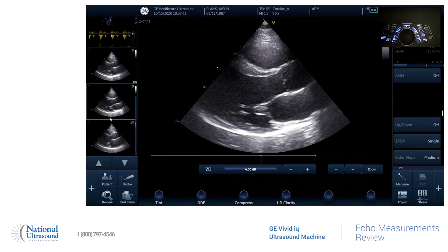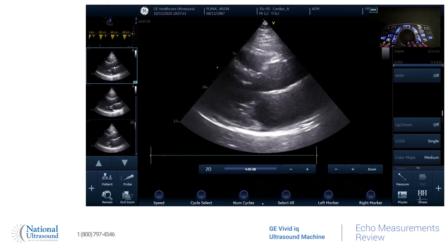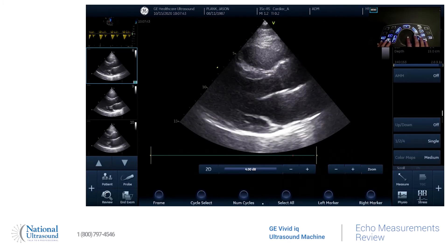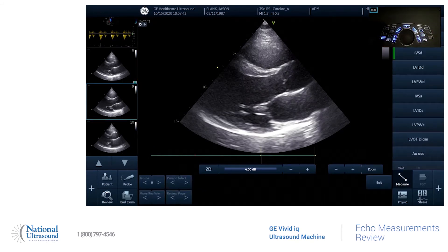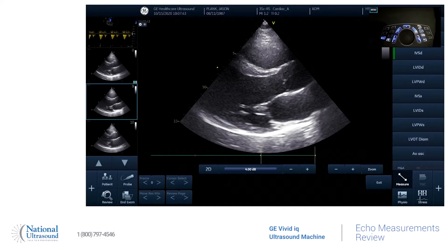So we are going to be doing an echo. I have already saved a couple images in clips. If we are trying to get the LV measurements, we can use the pause button to measure after the fact. Then we're going to go over here to our measure option. There are different folders for all of your different dimensions, velocity measurements, area volume. So we're going to go into dimension.